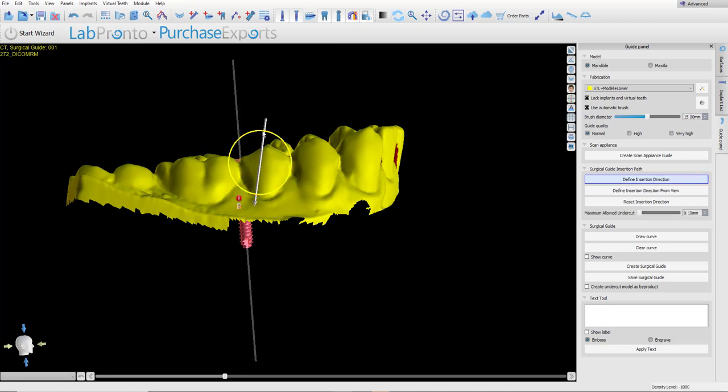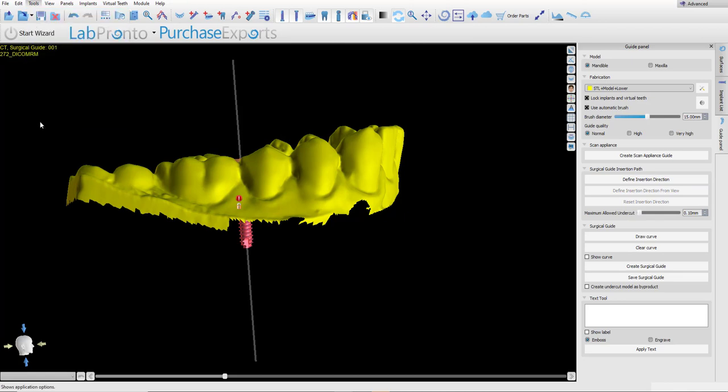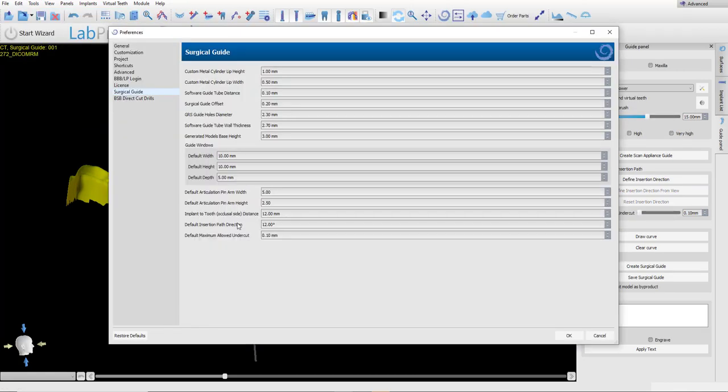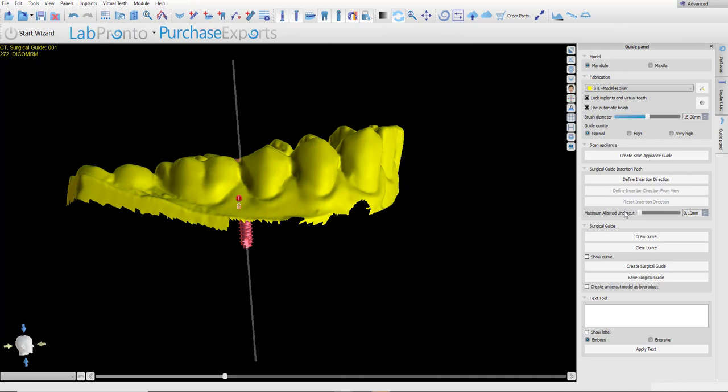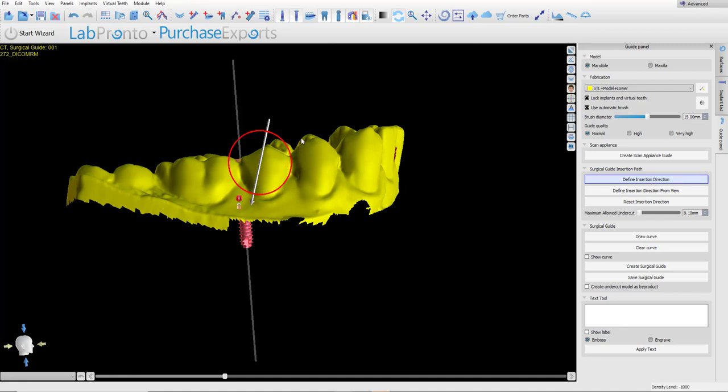We could see the default 12 degrees that we saw previously and preferences default insertion path direction of 12. If we want to change it for the particular case, simply rotate the arrow or orient the model properly in the view and then click Define insertion direction from view. Either way, once the path of insertion has been updated, simply click Draw Curve.